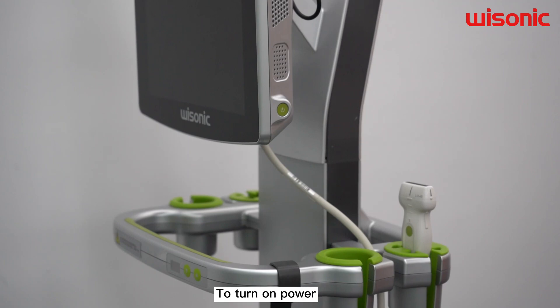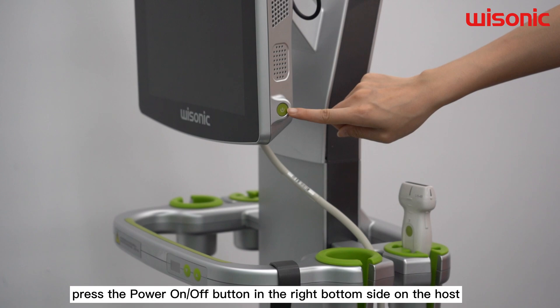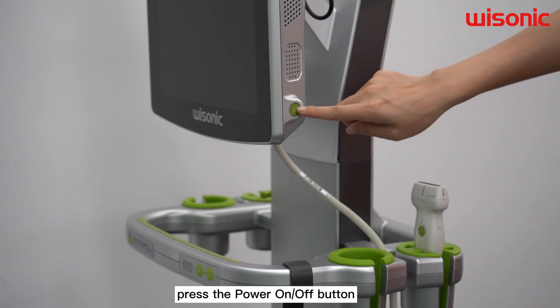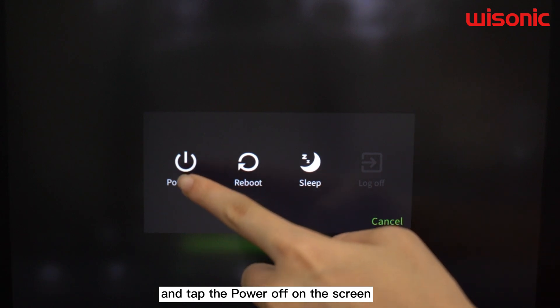To turn on power, press the power on and off button on the bottom right side of the host. To turn off your system, press the power on and off button and tap the power off on the screen.